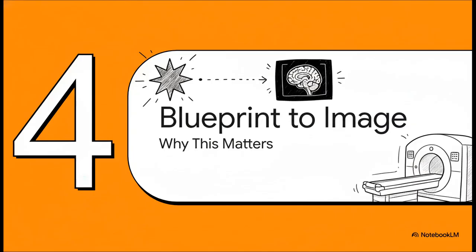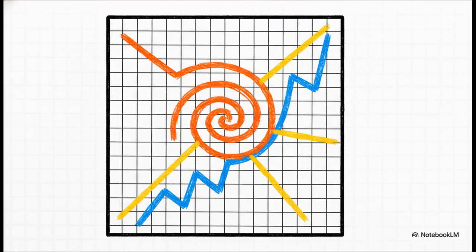But why does this actually matter? Why is this not just some academic exercise? Why should you care about this in the real world? Because it's all about making MRI faster and better. Once engineers understood that the center gives you contrast and the edges give you detail, they could start inventing clever shortcuts. All the modern fast scanning techniques are basically just fancy, creative ways of filling K-space more efficiently, like using a spiral path to grab that important central data first. This knowledge is what drives innovation.